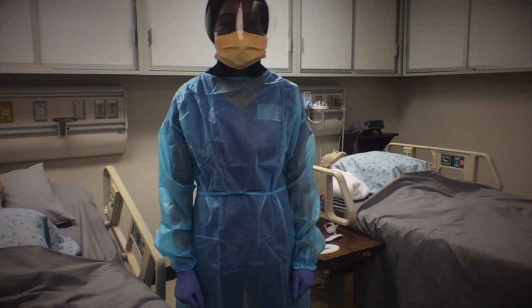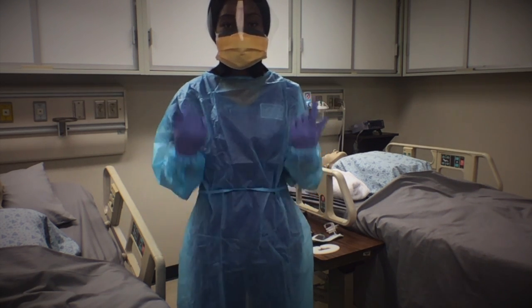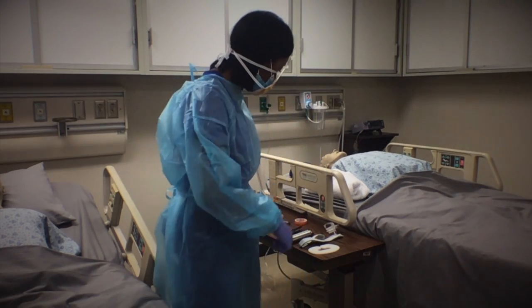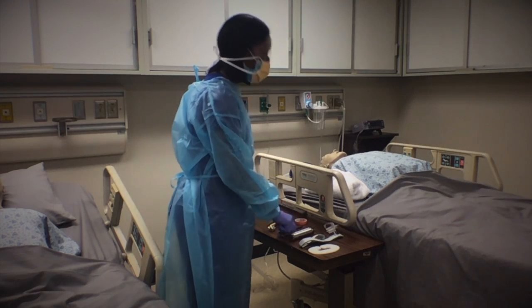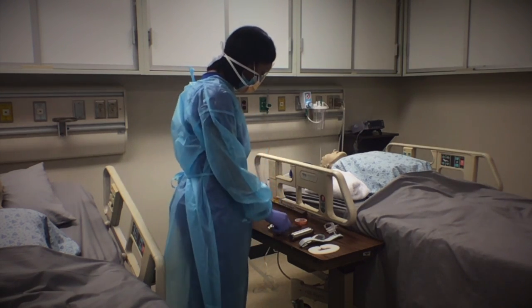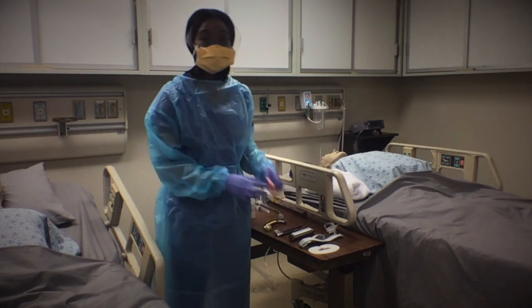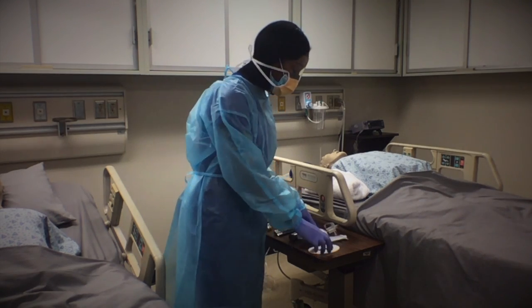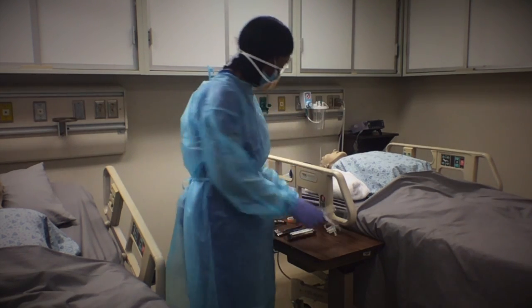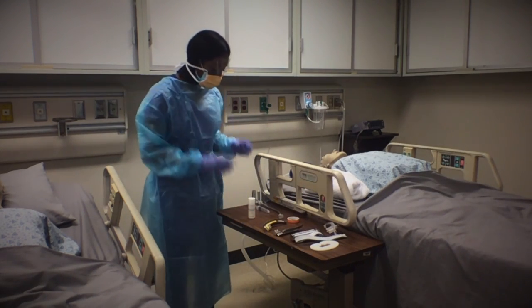I now have on my required PPE, which includes my gloves, my gown, my face shield, and my mask. I have my laryngoscope handle, the Miller blade, the Macintosh blade. I have my tape. I have my commercial tube holder and my security device. I have my colorimetric CO2 detector.